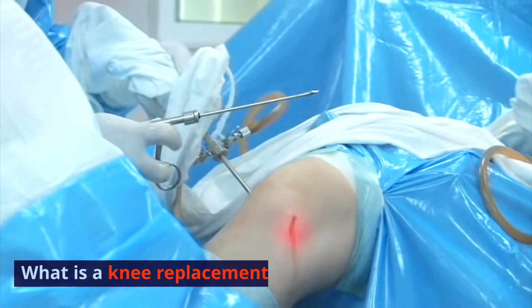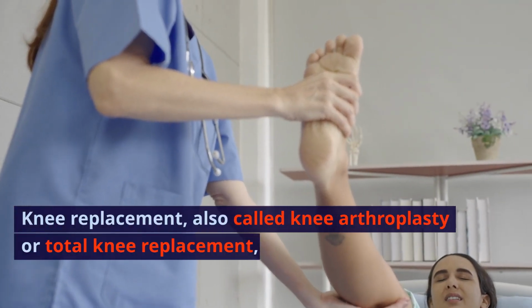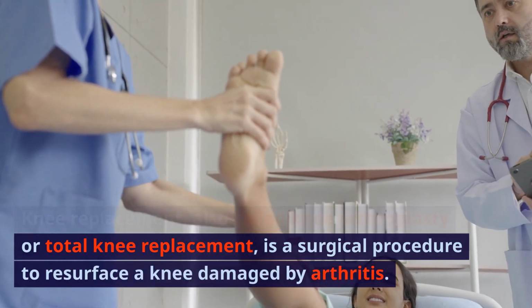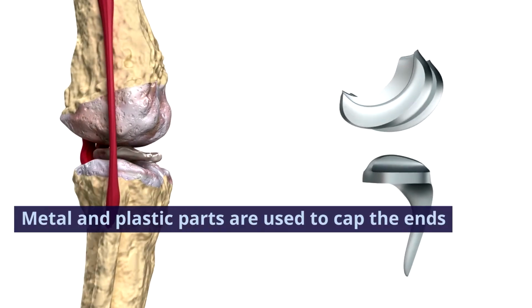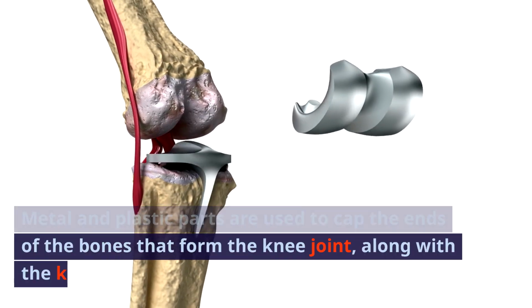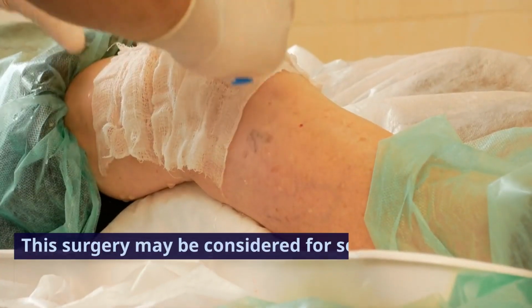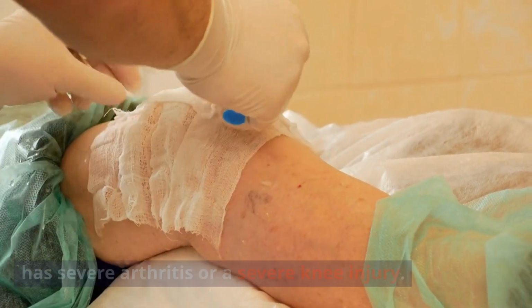What is a knee replacement surgery? Knee replacement, also called knee arthroplasty or total knee replacement, is a surgical procedure to resurface a knee damaged by arthritis. Metal and plastic parts are used to cap the ends of the bones that form the knee joint, along with the kneecap. This surgery may be considered for someone who has severe arthritis or a severe knee injury.